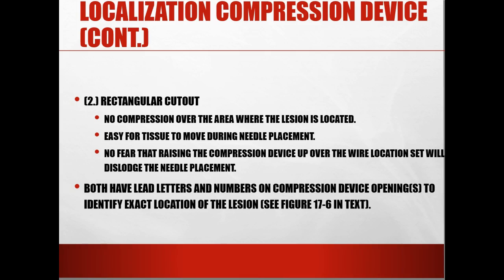As I mentioned, they both have the numbers and the letters so that you can use coordinates to identify where the location of the lesion is.